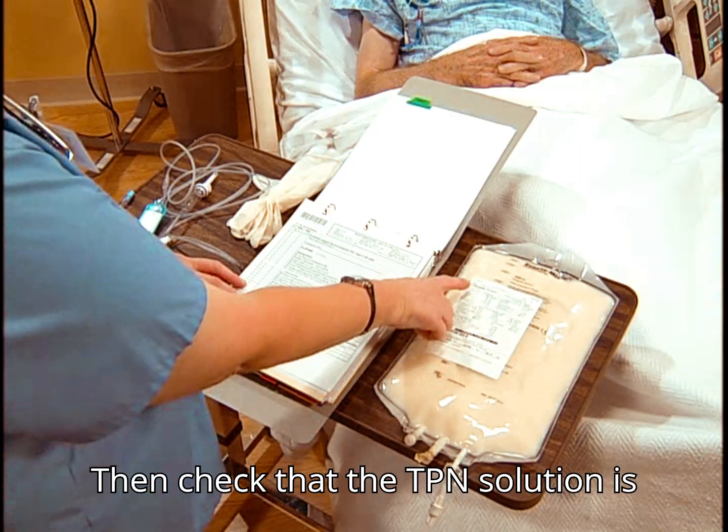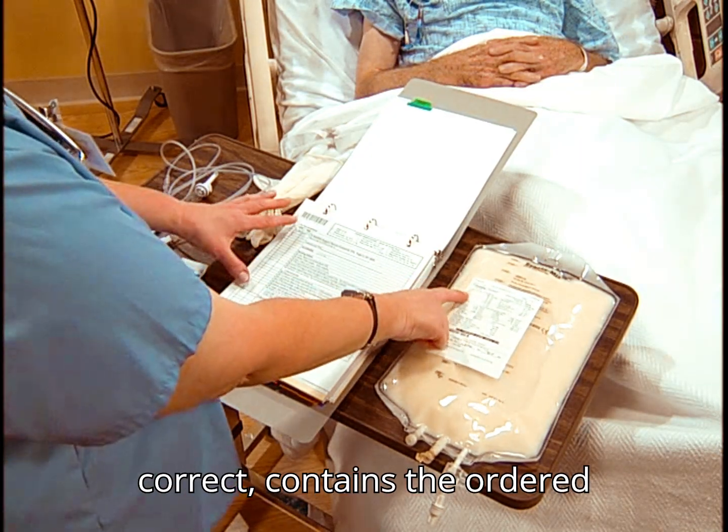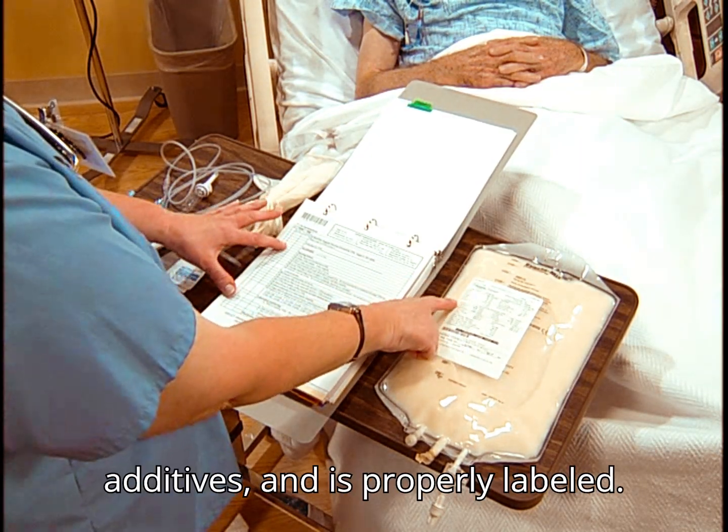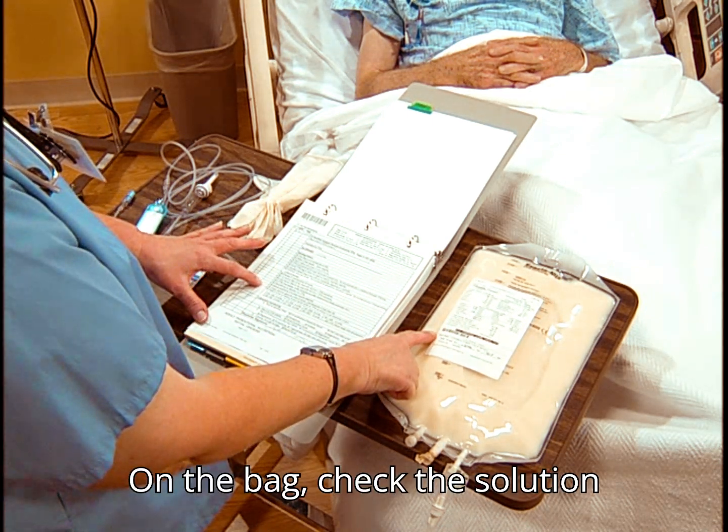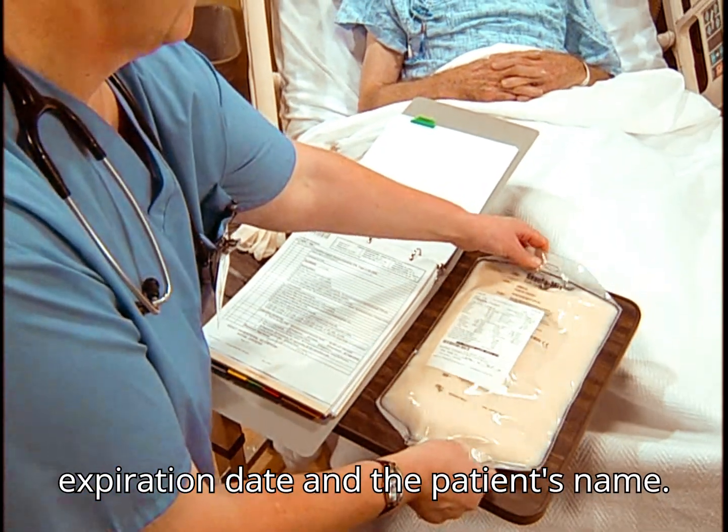Then check that the TPN solution is correct, contains the ordered additives, and is properly labeled. On the bag, check the solution expiration date and the patient's name.